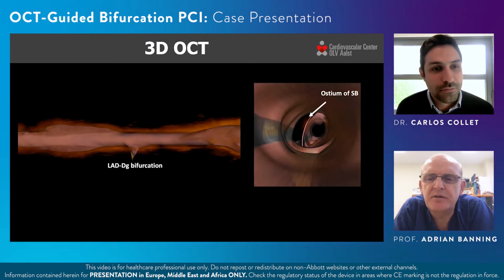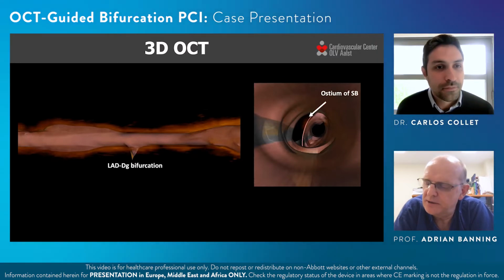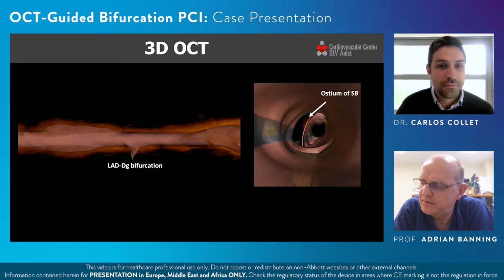And the patients tolerate that pretty well? Pretty well. We have no issue with the patients with this technique. Great, because they are spectacular pictures given the severity of the stenosis.